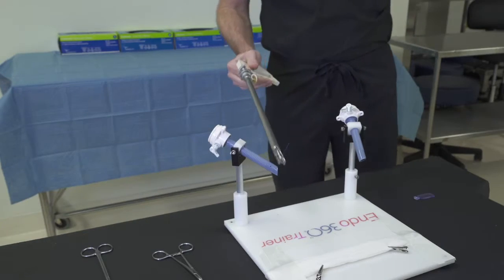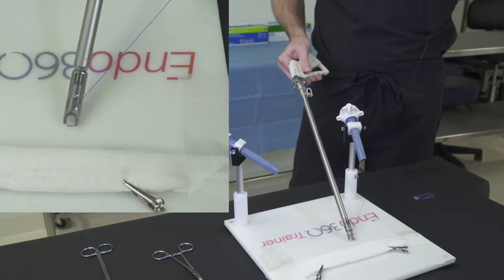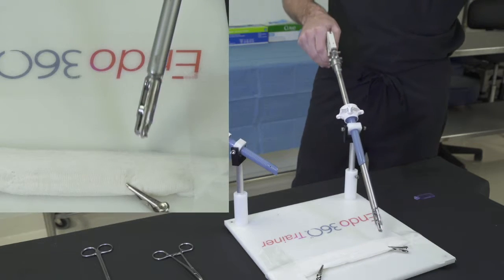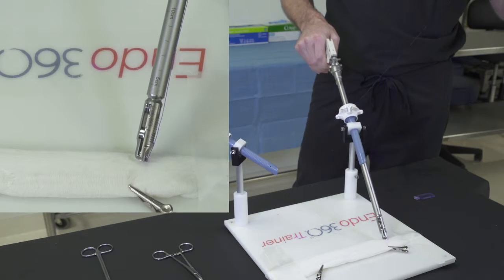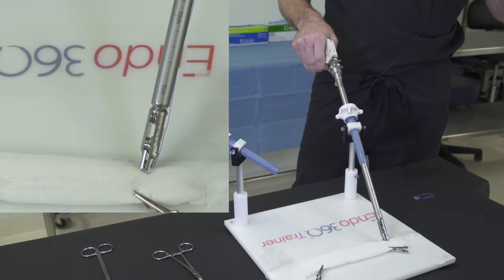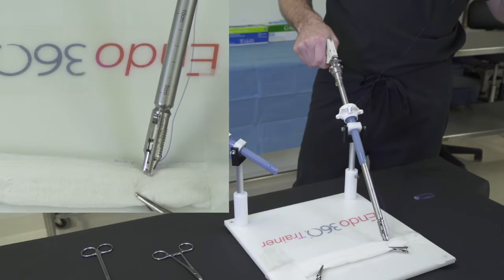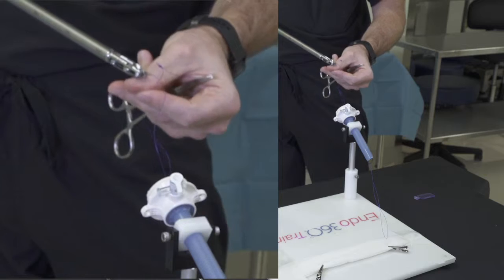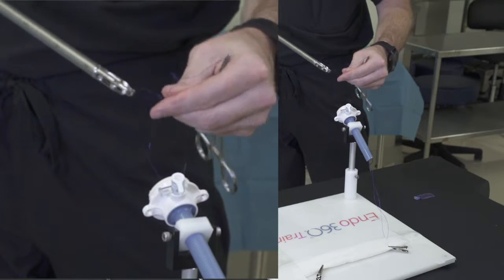Now for our first throw, what I'm going to do is I'm going to make sure that the suture is closed, and I'm going to come through and I'm going to take my first bite of the mesh. And typically I'm going to want this first bite to be in the very left lower side so that I can start to drag and carry the suturing from left to right.